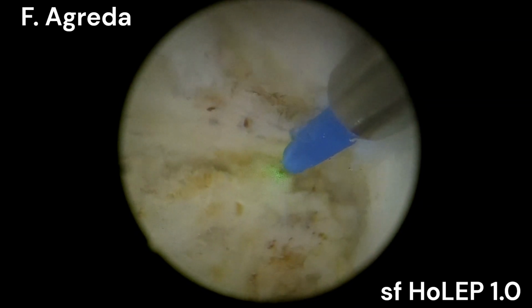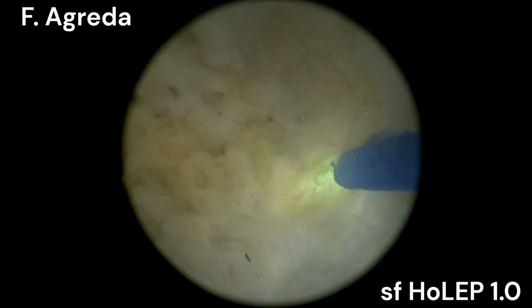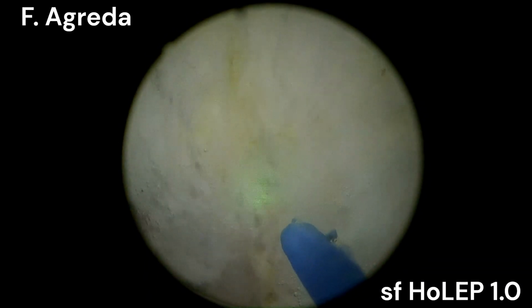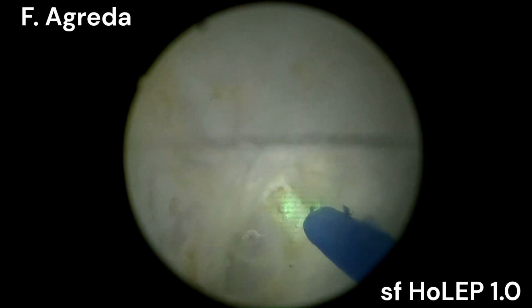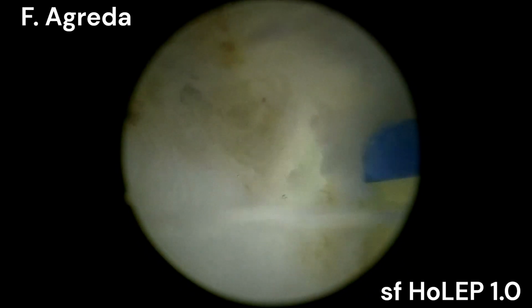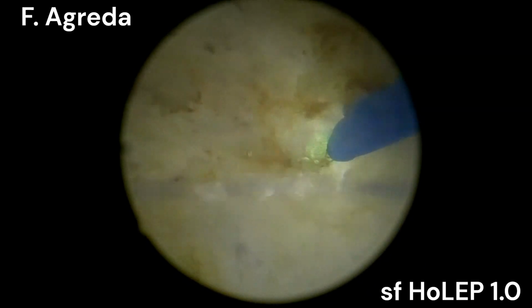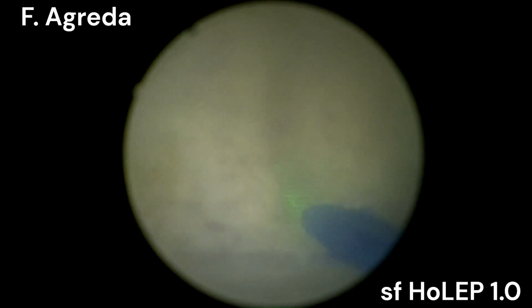As you can see here, you have to connect that dissection we did there on the first part of the surgery with the lateral and I would say posterior aspect of the left adenoma here, as we progress towards the first plane of dissection. We have to make these two planes to do a complete correct plane of dissection. That's it. That's the first step.